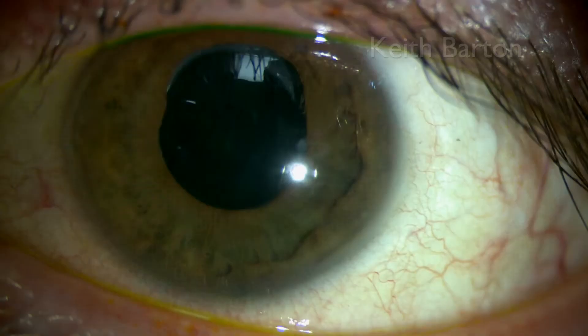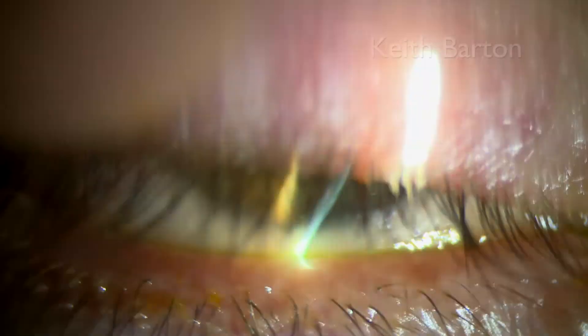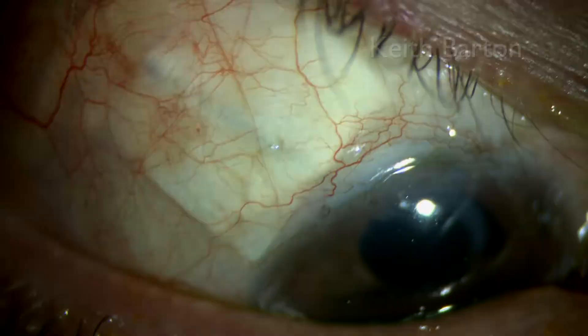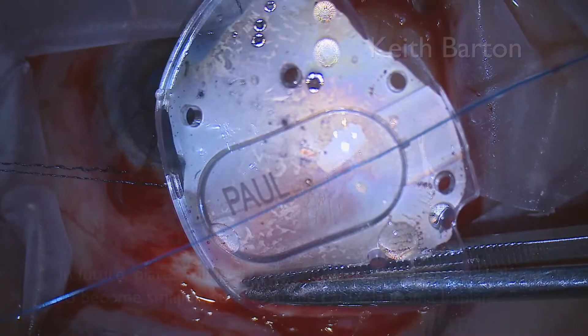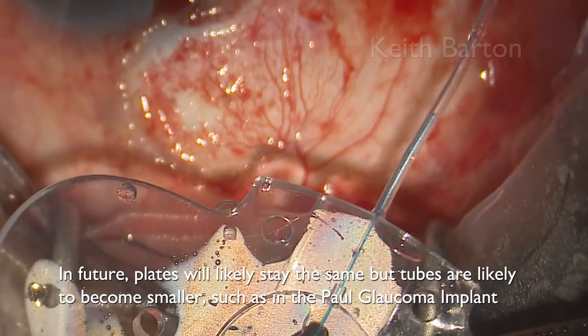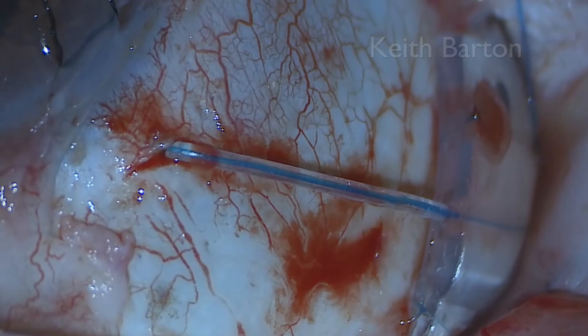This is the appearance 12 years after surgery in the left eye and 17 years after surgery in the right eye of the same patient. The Baerveldt glaucoma implant has revolutionised the care of such patients since the mid-1990s. In future, plates will likely stay roughly the same, but tubes are likely to become smaller, such as in the Paul glaucoma implant. I wanted to dedicate this video to the memory of George Baerveldt, who very sadly died just over a month before I started to put it together. Thank you very much for watching.